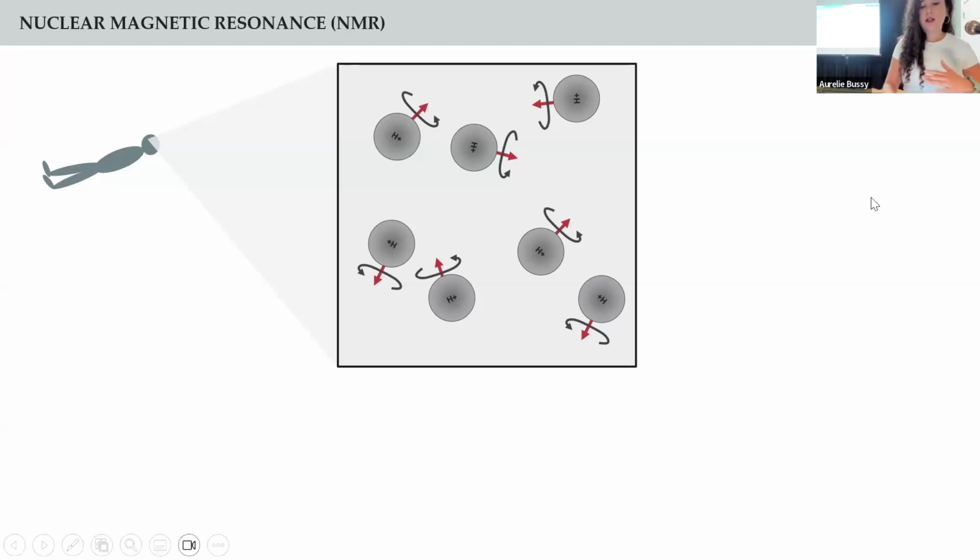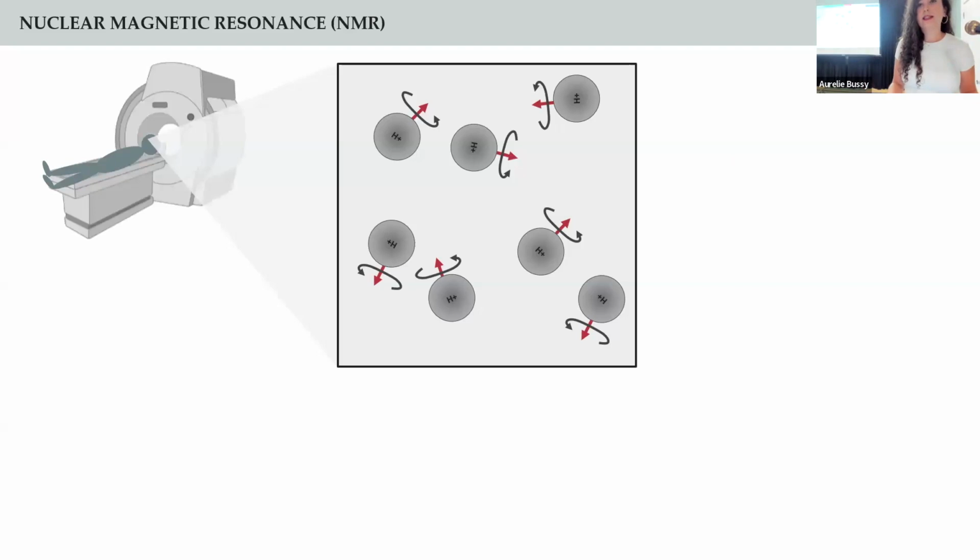And each of these magnets will be oriented in a different orientation in normal conditions, let's say right now in the room. This tiny magnetization I represent here as these tiny red arrows, these tiny vectors. If you think about thousands and thousands of spins in one voxel and you sum them up, because they are randomly oriented, the magnetization would be 0 because they all cancel each other out, okay?